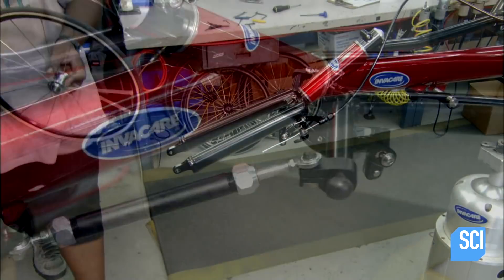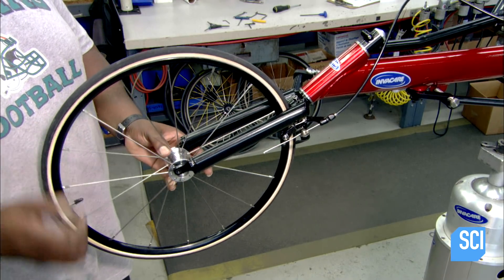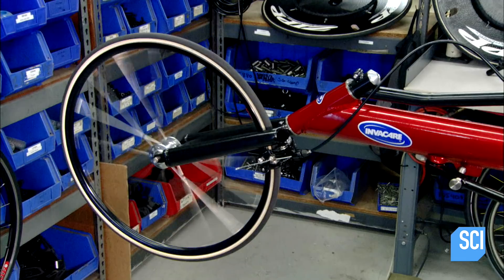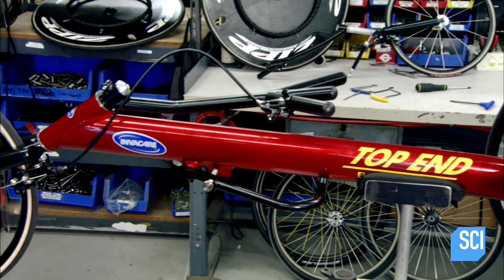After testing the steering fork, they install the front wheel, which is smaller than the rear two. Once it's been equipped with brakes, this custom racing chair is ready to take on the competition.